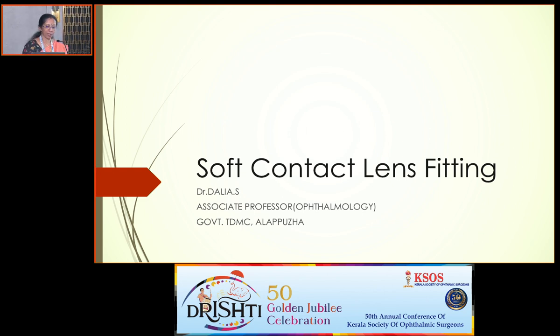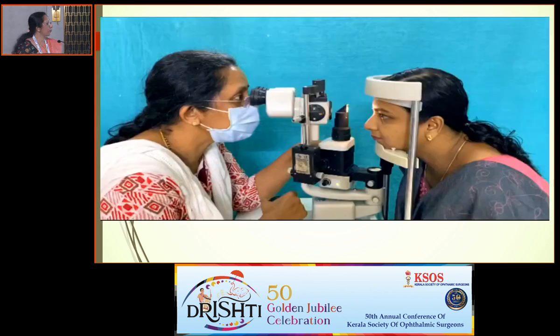So my topic today is soft contact lens fitting. Whenever a patient comes to us for a contact lens fitting, we have to look into many factors before we order a contact lens for the patient.